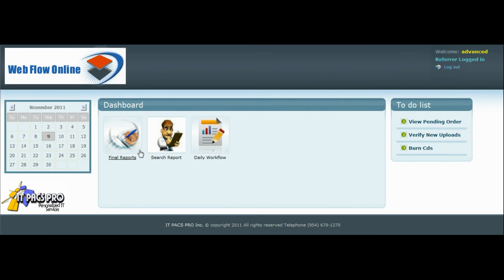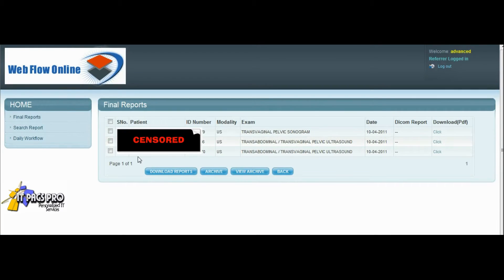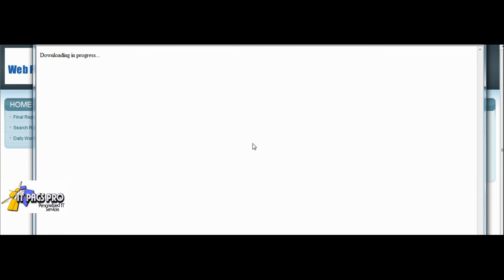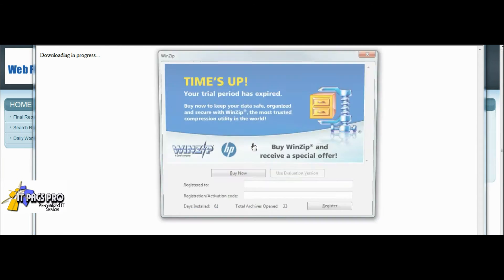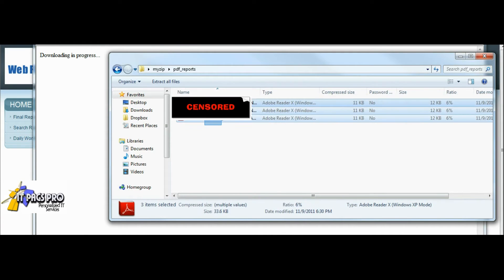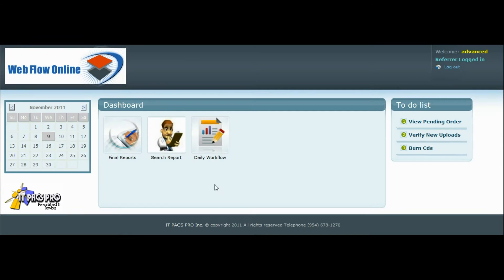Here is what the imaging center's referring physicians will see. They will click on their dashboard and view the final reports. They can check off exams and download all of them at one time — it will arrive in a zip file. The user can open them all, print them, store them, save them, or upload them into any other system or EMR they wish.